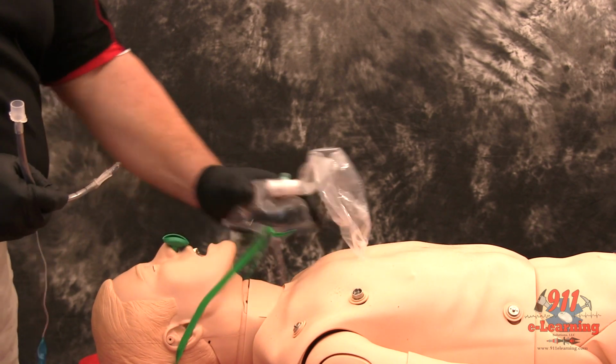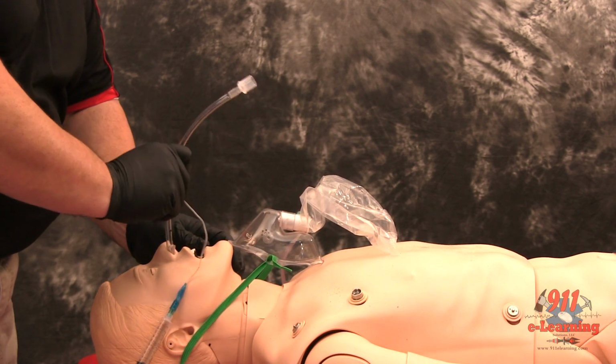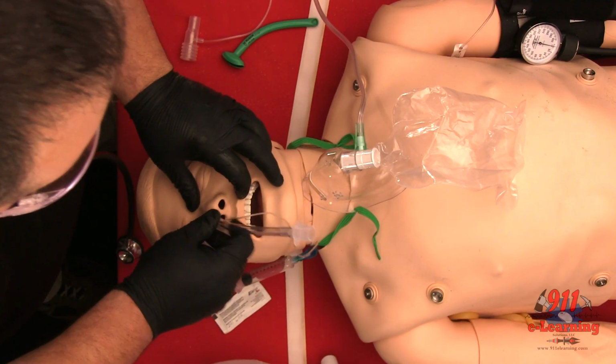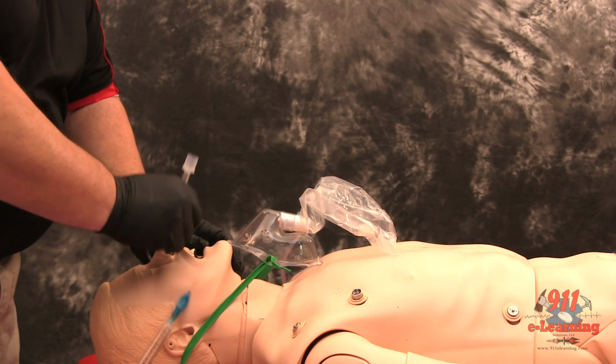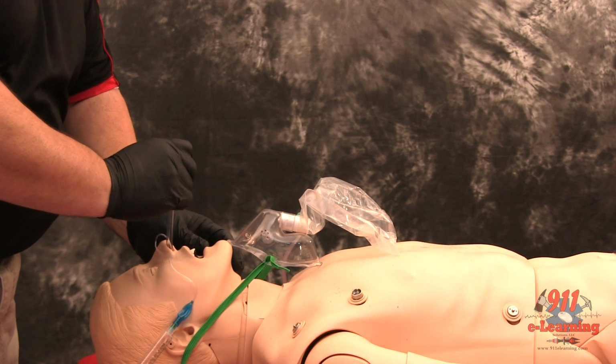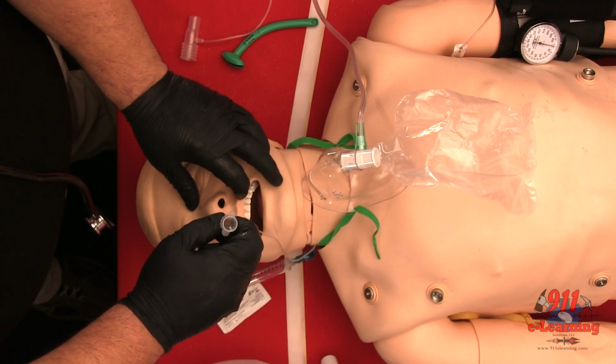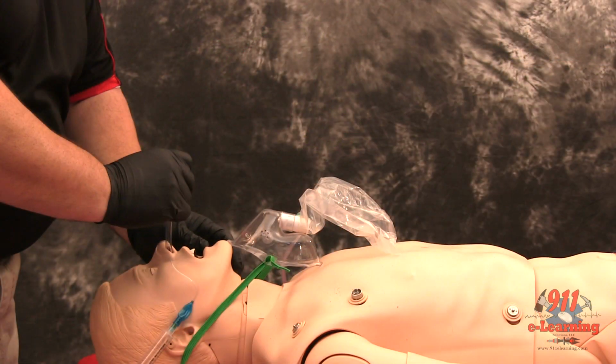Remove the nasal airway and gently insert the tube, keeping the bevel of the tube toward the septum. Continue to pass the tube, listening for air movement and looking for to and fro vapor condensation in the tube. As the tube approaches the larynx, the air movement gets louder. Gently and evenly advance the tube through the glottic opening on inspiration. This facilitates passage of the tube and reduces the incidence of trauma to the vocal cords.